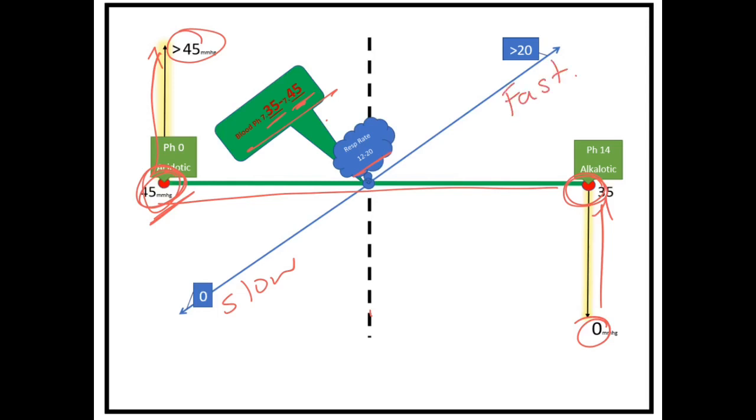So how does this deal with our patients when we have someone who has a narcotic overdose, or someone who is maybe having hyperventilation? They're breathing super fast. So what are we talking about here? We have a narcotic overdose, specifically an opiate, and it's causing them to breathe really slow.